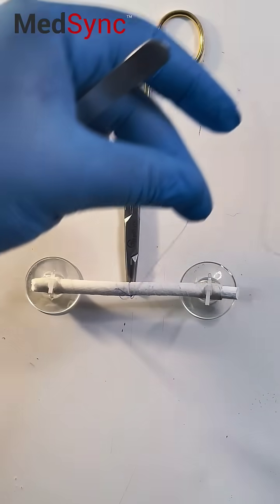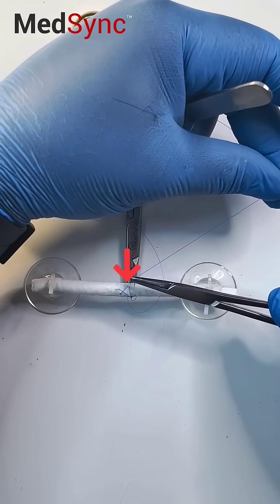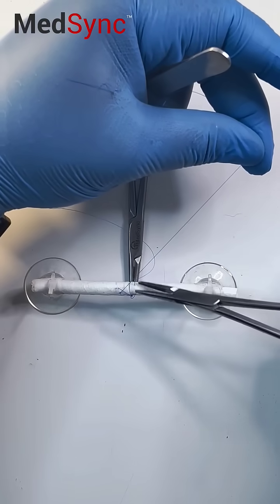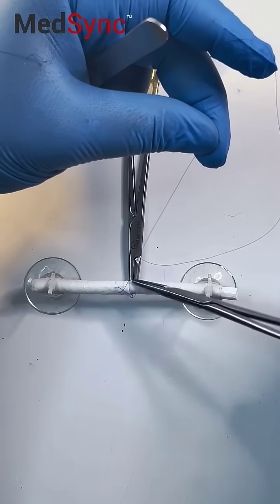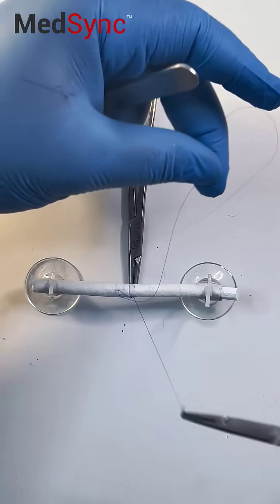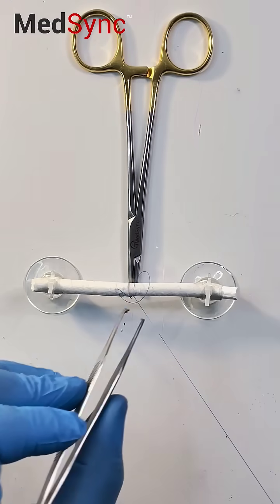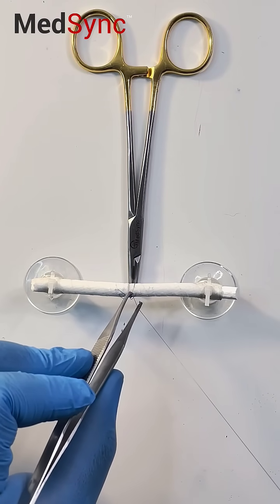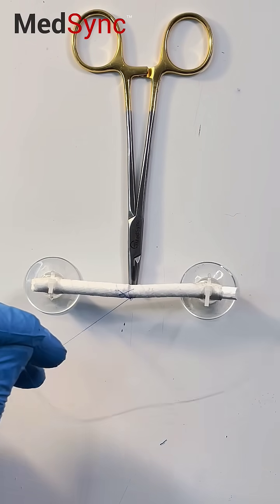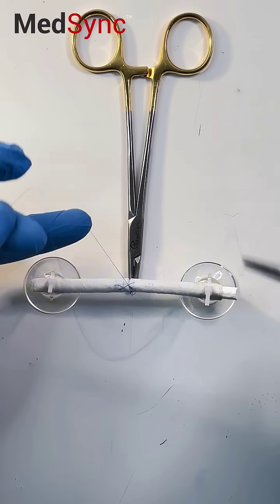My next bite is going to be starting over here. I'm applying counter traction with the suture and rotating the needle through. Mount it straight away. And this bit is key: guide the suture material to lay where you want it. This way it tidies up the repair site and your figures of eight are as you want them and as you need them.